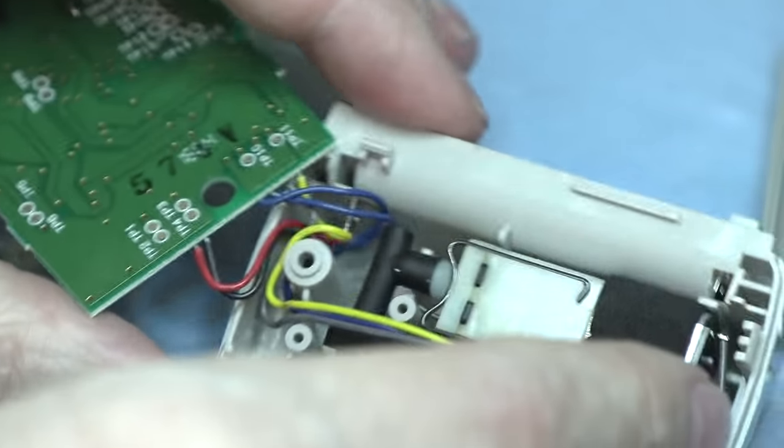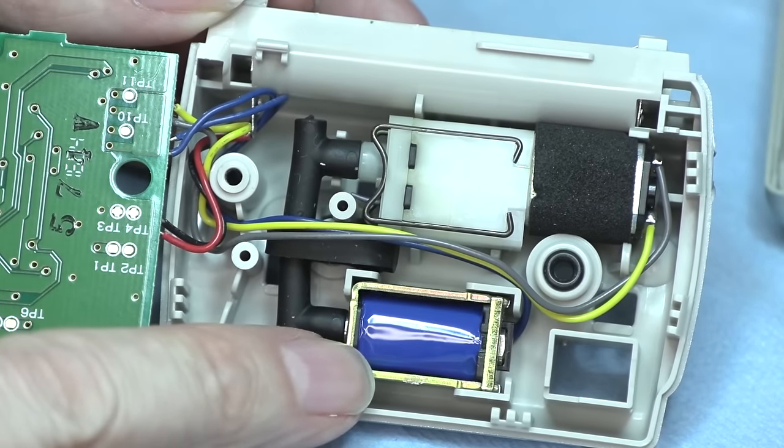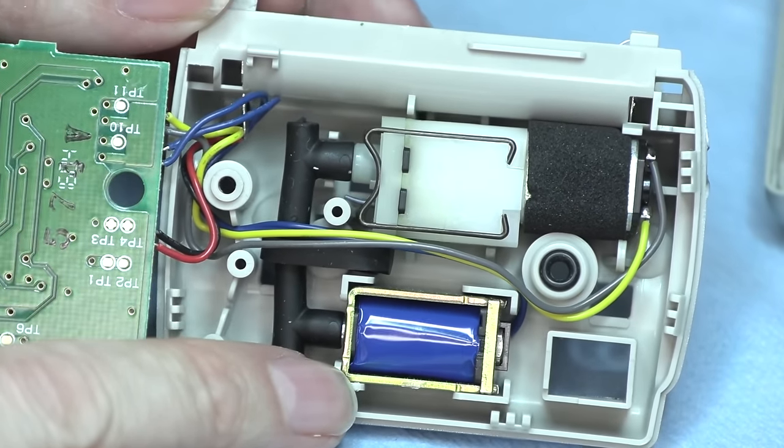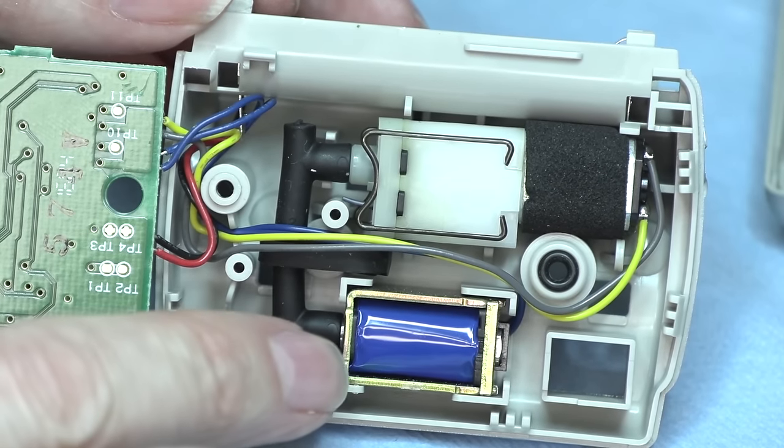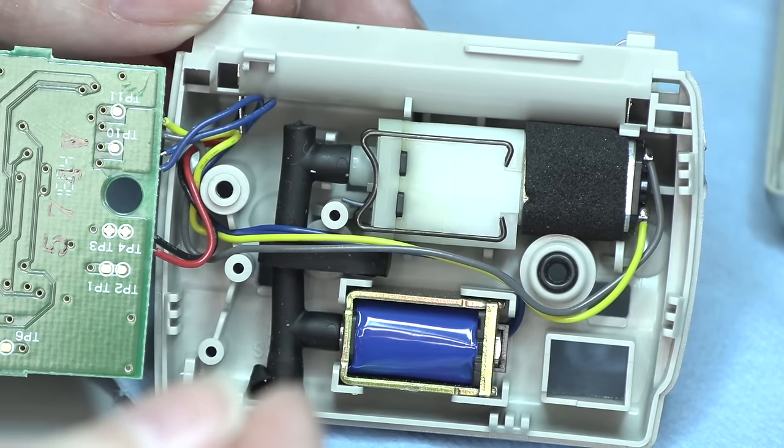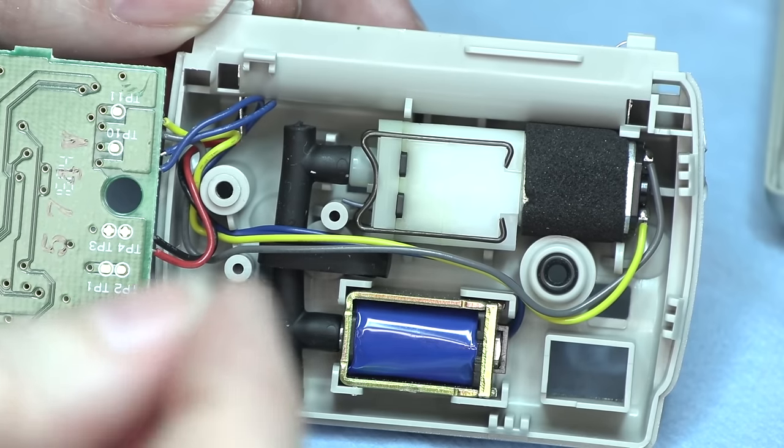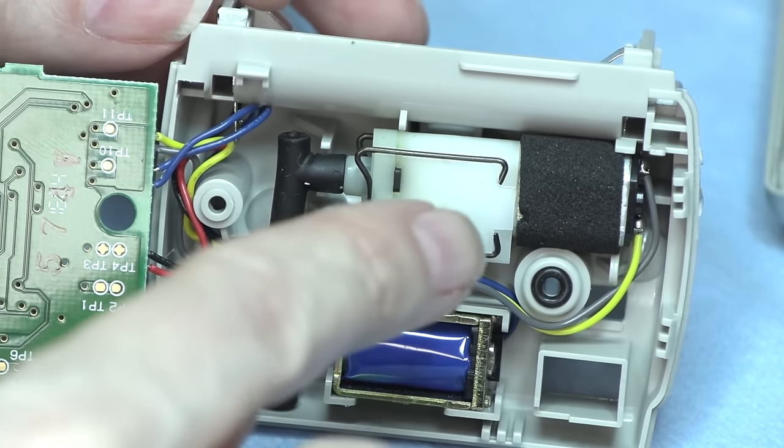And then here we go. This is where the magic happens. That looks like a little valve there. That's a solenoid. That's probably the relief valve to open and close the whole system. Would be my guess. Because it holds the pressure and then it lets the pressure out. And that looks like just a valve. And that's the pump.